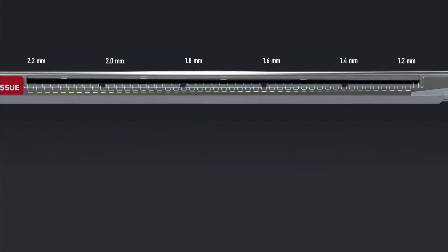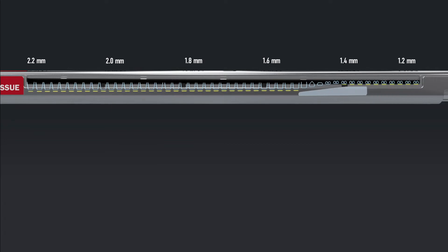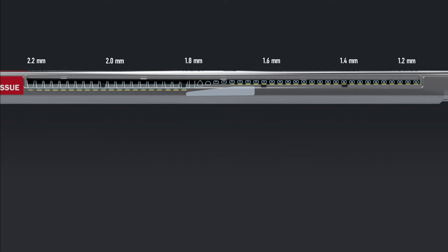Titan SGS provides confidence that an optimal, secure staple line is forming in gastric tissue. With localized tissue compression zones and larger anvil staple pockets, Titan SGS minimizes the chance of misaligned or malformed staples impacting surgical results.